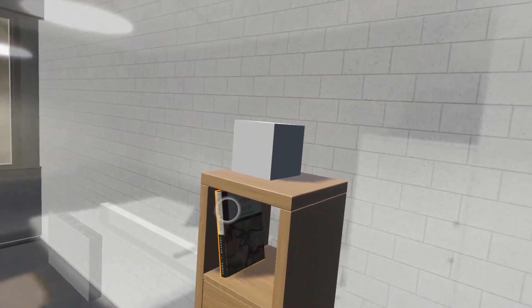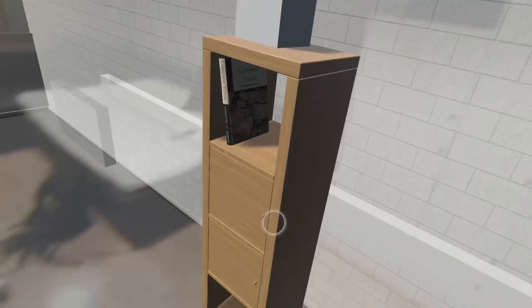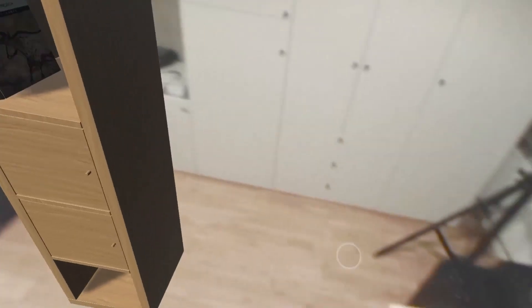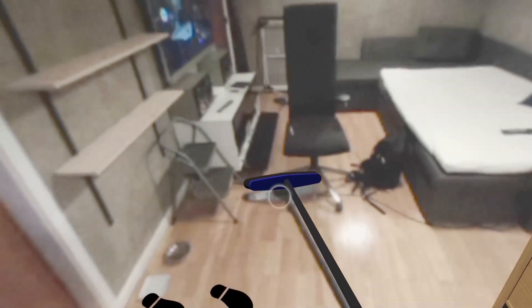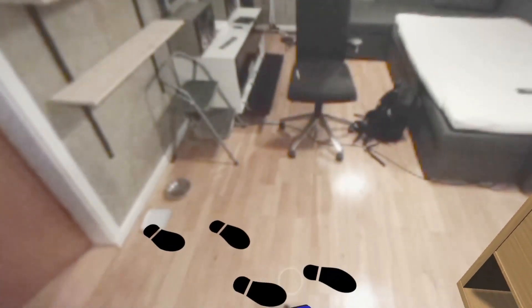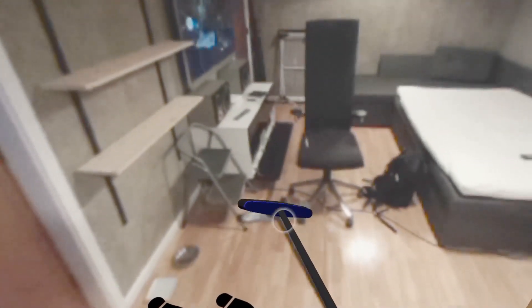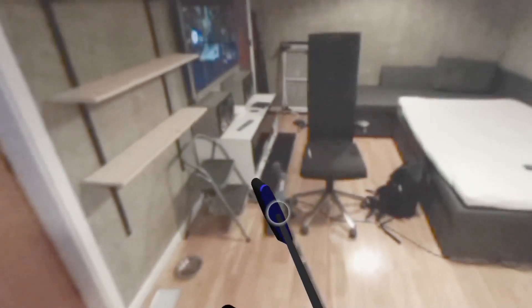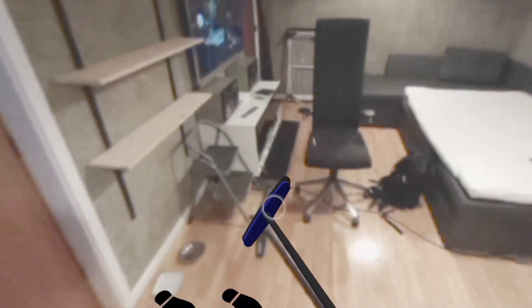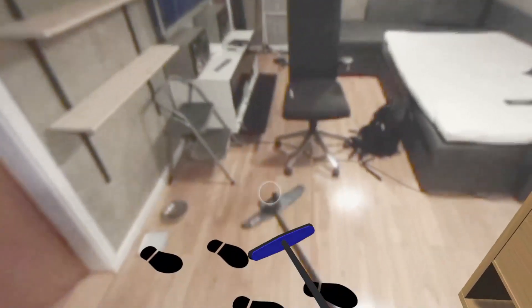Now, real-time camera feed is used as background, creating an augmented reality experience. The real broom is tracked by the same sensor system which tracks the virtual reality headset. There is a small latency between the real broom from the video feed and the virtual broom aligned with it.